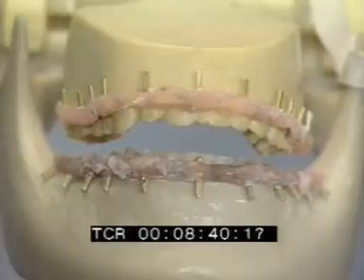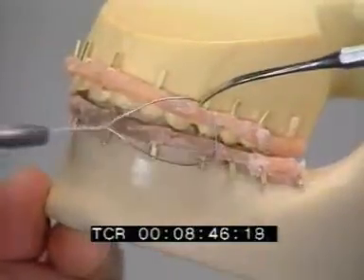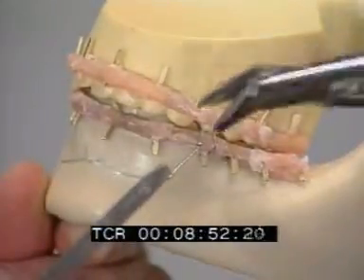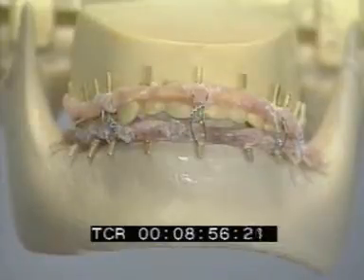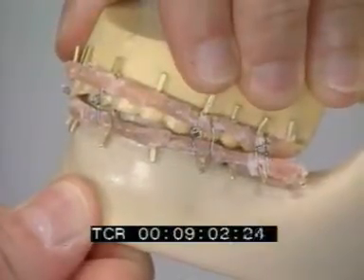The occlusion is established, and 0.4 mm wire loops are inserted in a symmetrical fashion to connect the two arch bars. The wire ends are trimmed and bent to avoid injury to the mucosa. Finally, the jaw is immobilized in maximal intercuspidation. Functional load applied to the mandible demonstrates the stability of the system.